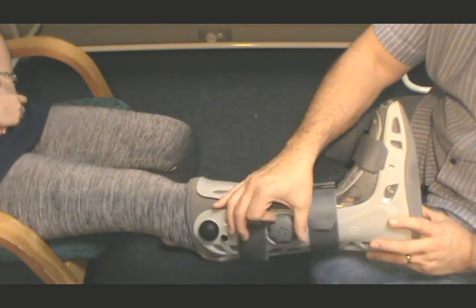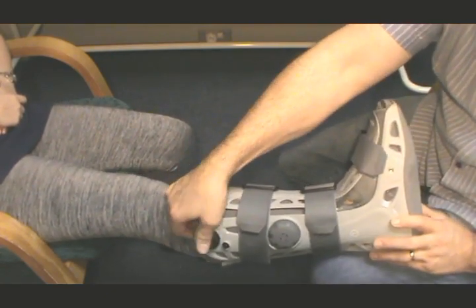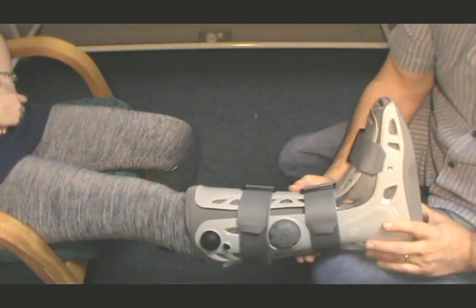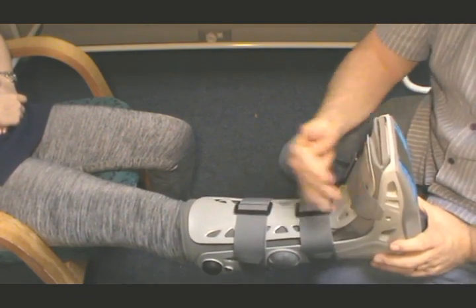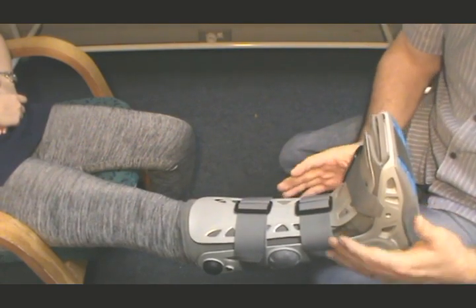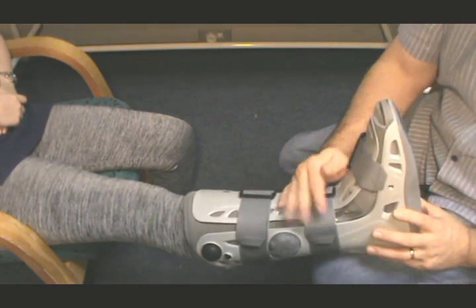Then you're going to move the dial over to 2, and then for the other side, you're going to pump that as well. So we go 1, 2, 3, and Amy said that she can start feeling it after the third pump. Now, both those bags are now inflated. So if you take the boot off, the bags will stay inflated, and you will battle to get your foot back into the boot. So you have to try and remember to always deflate the bags before you remove the boot.